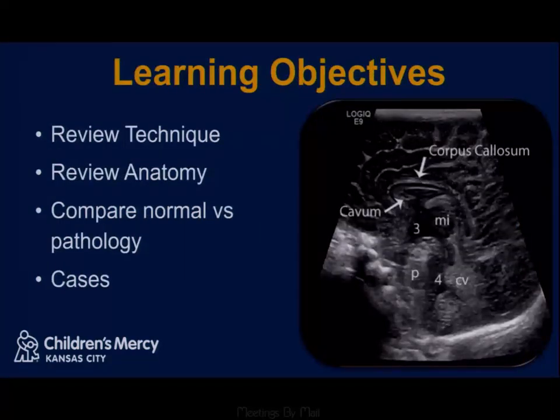So for the learning objectives of this talk, I want to review the technique, review normal anatomy, compare normal anatomy variants versus pathology, and then go through a number of illustrative cases.